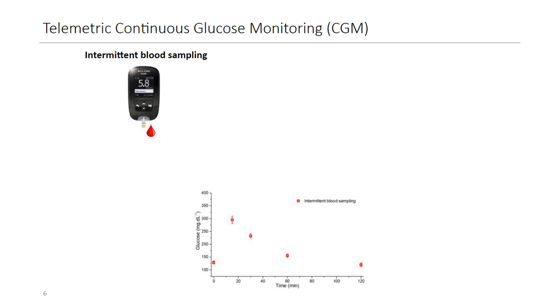First, generally, what has been a standard technique that is being used to determine the glucose tolerance is a glucose tolerance test. And in this test, you first fast the mice for 6 hours, then you administer glucose, and then during 5 time points in a time span of 2 hours, you take a blood sample, and in this blood sample, you measure the blood glucose using a standard glucometer, as shown in the top left side of this slide, which is also used by diabetic patients.